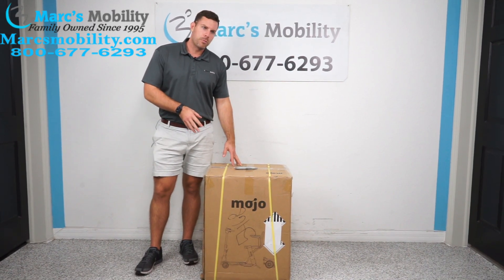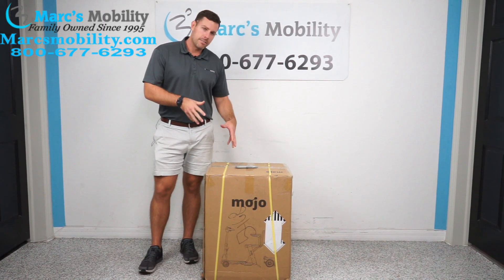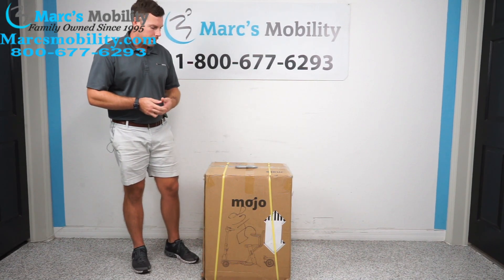In this video, we're going to show you a new product that Enhanced Mobility just released called the Mojo Auto Folding Scooter. In this video demonstration, we're going to show you the unboxing, and then later on, you're going to see a video demonstration about the actual unit.